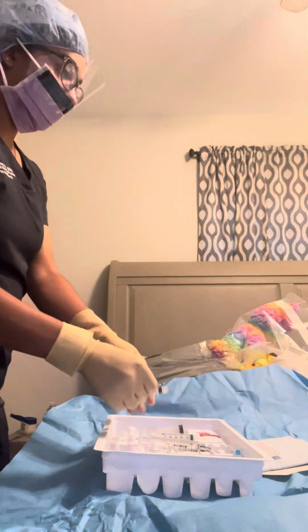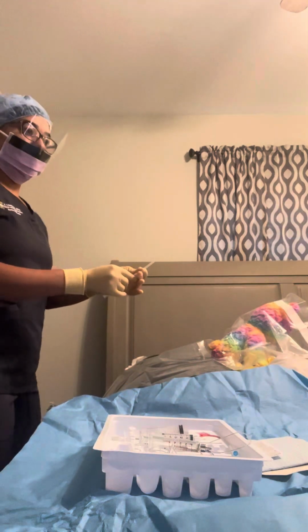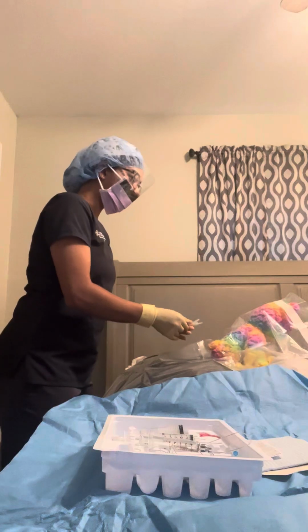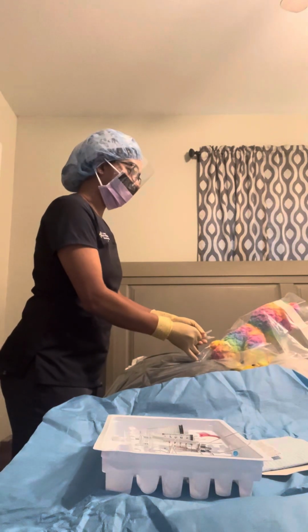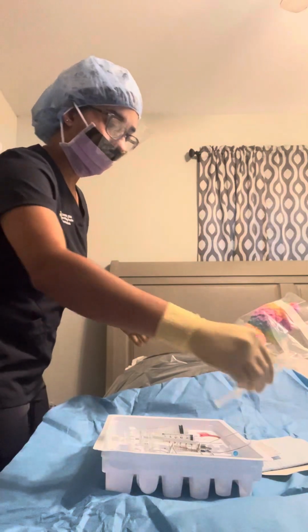With my lidocaine syringe, I'm going to use lidocaine 1% to create a skin wheal, and I'm going to inject the needle 15 degrees cephalad, angled up and towards the umbilicus. And I will inject the lidocaine.